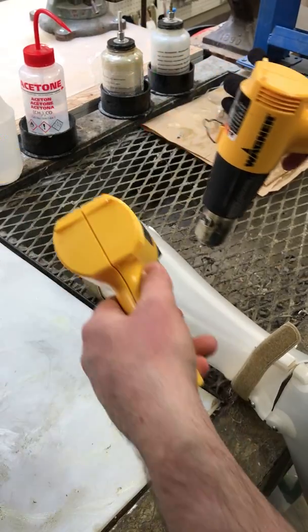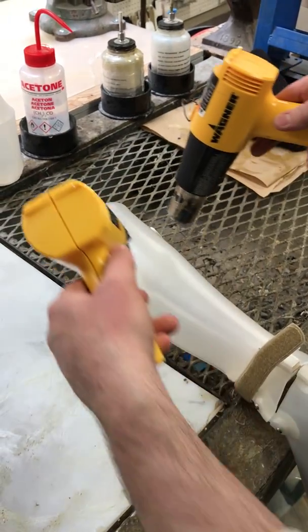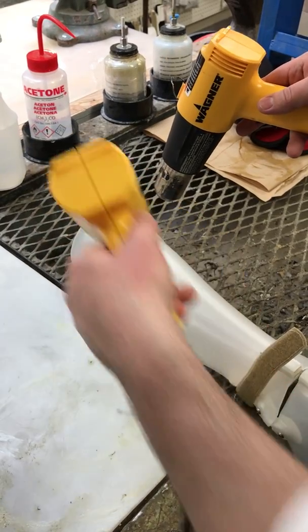You want to heat up a large portion of the plastic so that when this tightens you don't end up with a crease down the center line.